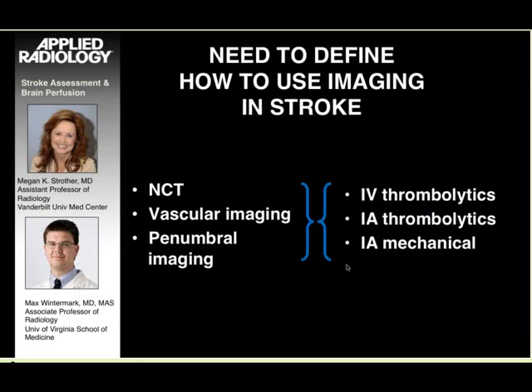There is still some debate on how to use those results, and typically people who want to extend the window for treatment of acute stroke need to decide how they are going to use this information together with the clinical information to obtain the best outcome possible for the patient.